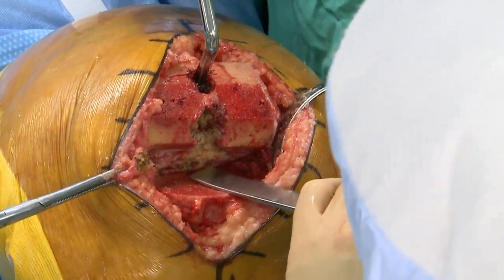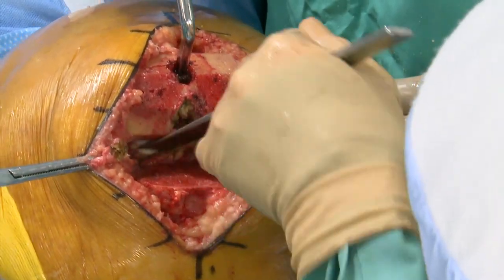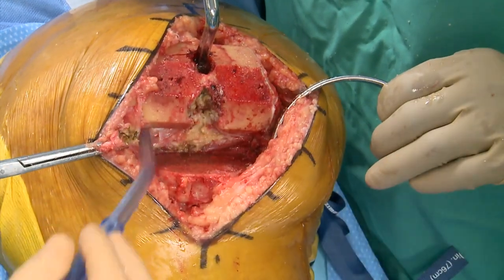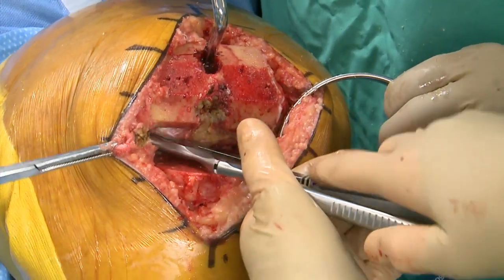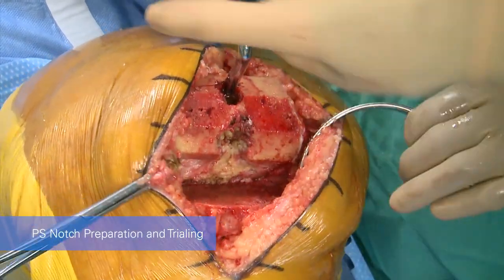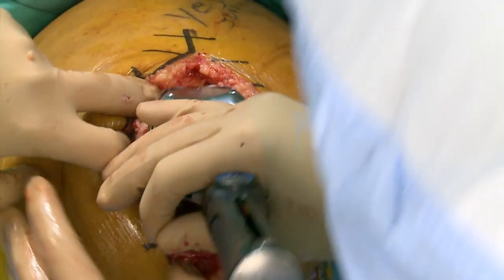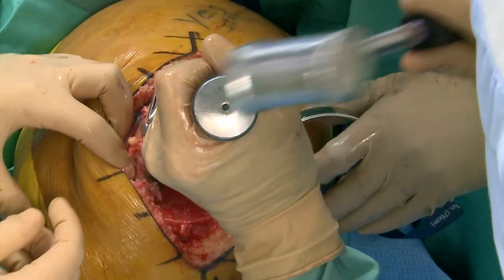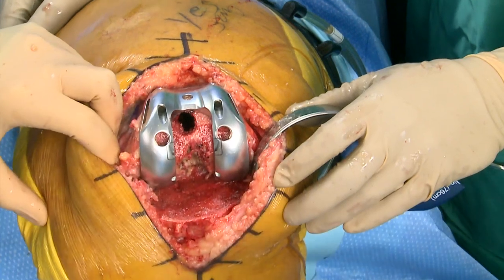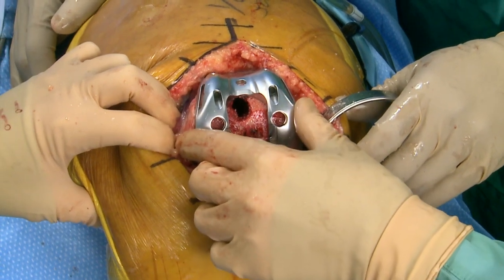She had a little bit of posterior osteophyte on the lateral view — we'll get that out. In a patient like this it's not going to be enough to really affect the extension gap. If I had a lot of osteophytes and expected the extension gap to open up, I would have left the femoral pins in until I knew exactly what my extension gap was after removing those osteophytes. So right now we're 13 millimeters in extension and 13 in flexion, and the polyethylene is 13. Now we're putting our trial femoral component on.